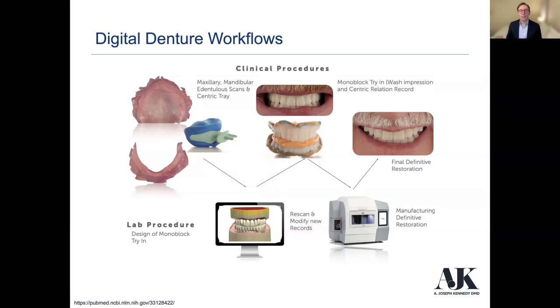You can also go ahead and take a functional impression here, do your border molding, if you're going to use light body or heavy body rather, to do your border molding, if you're using green stick compound, however you want to do it. Use these as custom trays. You know that you've got the teeth set up right, the midline looks good, everything's happy.